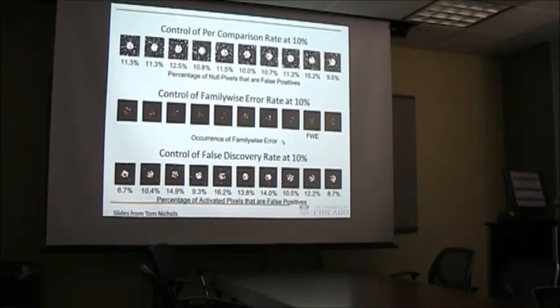And again, even disregarding any of the details of how these methods work, it's important to realize that if you're looking at your results tables from SPM, it might be the case that something is significant with an FDR correction, but not with a family-wise error correction.